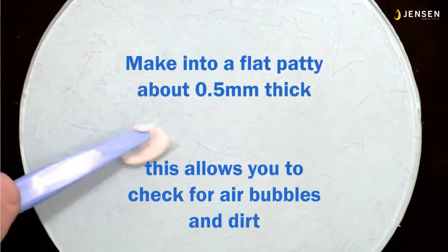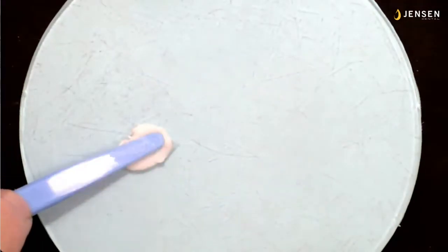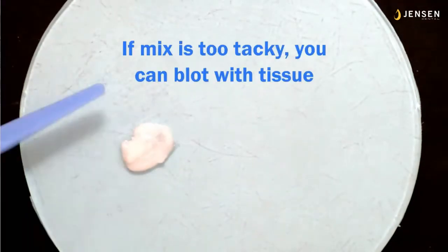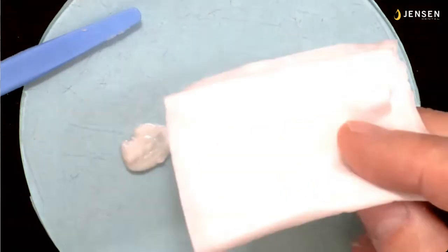And I'm going to try to make a patty about a 1/2 millimeter thick. This allows you to check and see if there's dirt in there or air bubbles or anything else. And sometimes it'll be sticky and it won't clear your spatula. It's kind of like chewing gum.